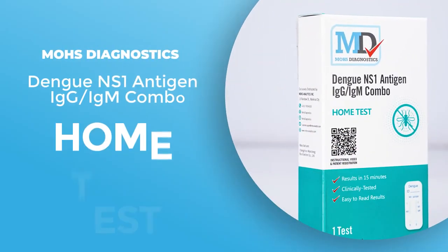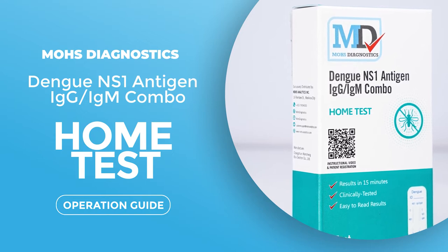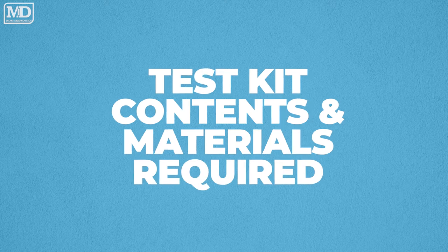MOS Diagnostics Dengue NS1 Antigen, IgG, IgM Combo Home Test Operation Guide. This section covers the test kit contents and materials required.